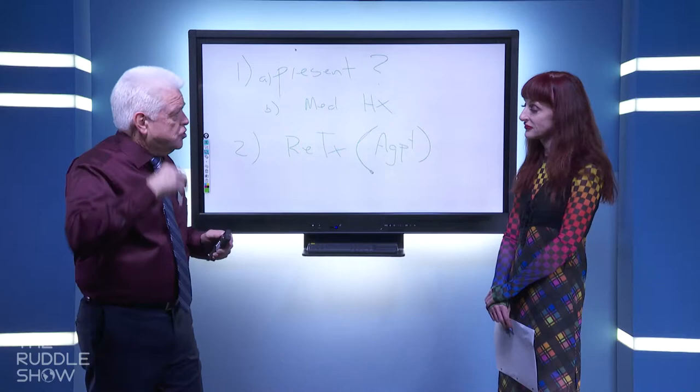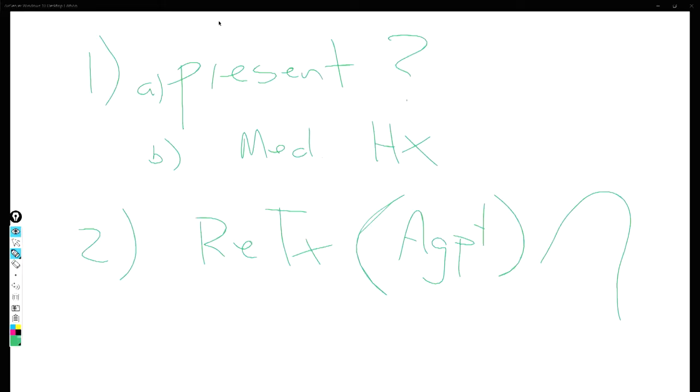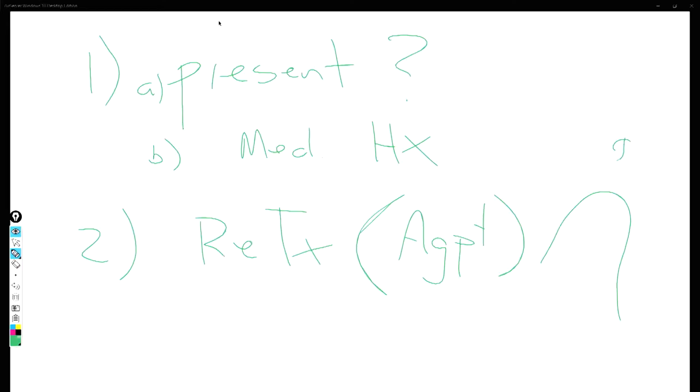You're operating from behind. So what if you have a tooth and you're treating it and it's necrotic? You go in, there's putrescence, it stinks, and your first file is up here.